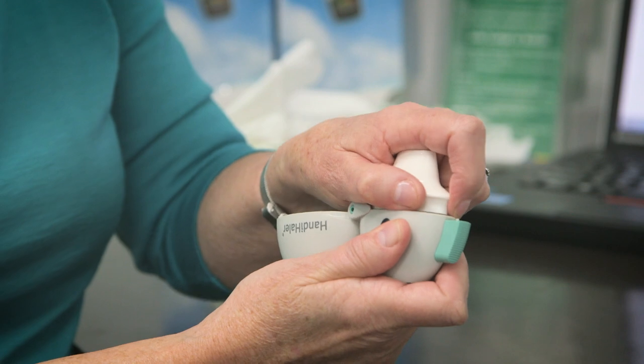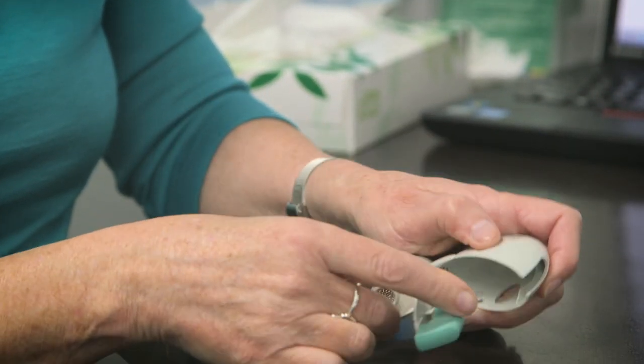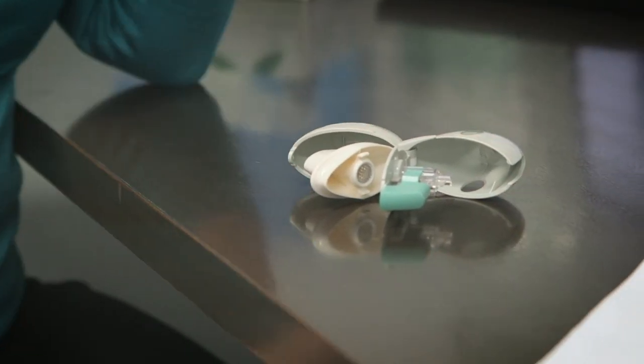Once a month you need to wash it. Open it up, open the mouthpiece, click it in, wash it in warm water, and leave it to air dry.